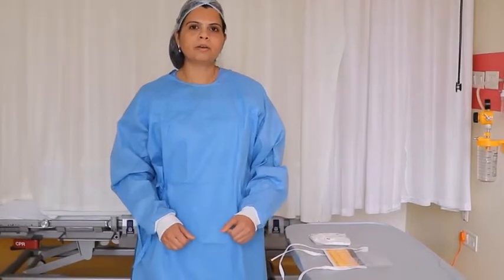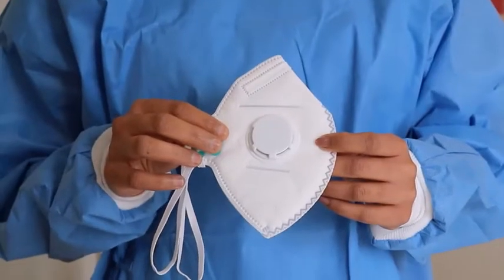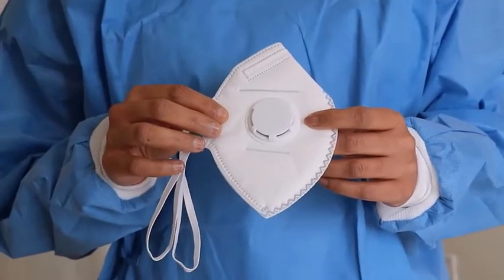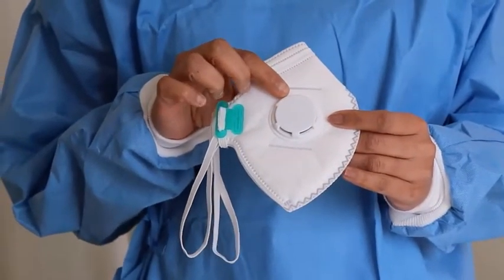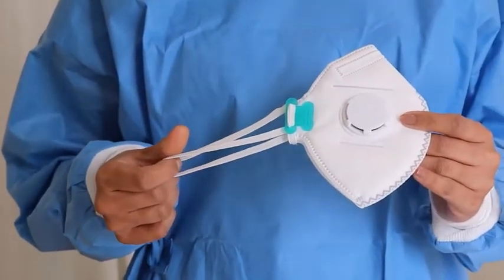Now I will demonstrate how to wear the mask. You would need to put on an N95 mask when your patient is on airborne precaution. It has one nasal cleat, one expiratory valve, and two straps to hold the mask properly.